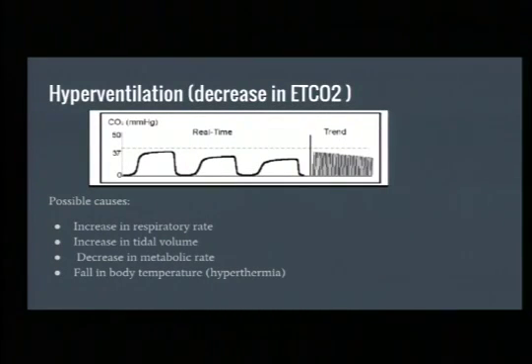If they're hyperventilating, so increasing your respiratory rate or an increase in your tidal volume, your anxiety patients, that's this increase in respiratory rate. They may not be taking in much. Sometimes they are. Other times they're just fast, and you can see their CO2 ticking down because they're blowing off so much, and then all of a sudden they get their carpopedal spasms and they freak out more. So it's a nice reassuring way when they say, oh, I'm asthmatic, and you really think they're having an anxiety attack. That's a nice way to put that on and see that response on them.